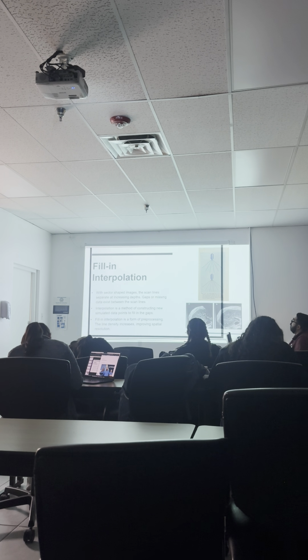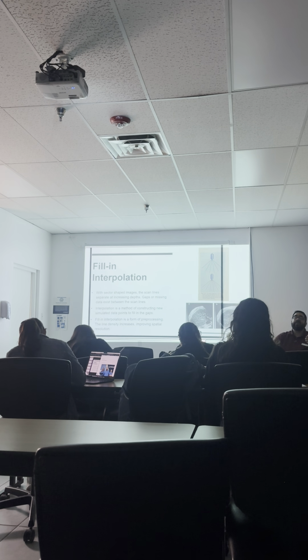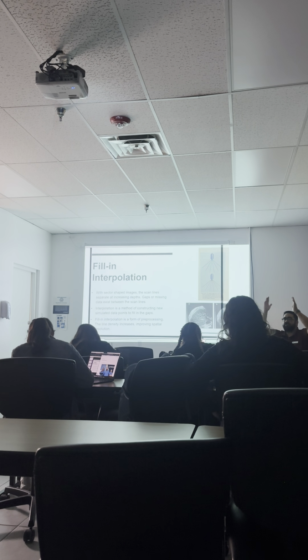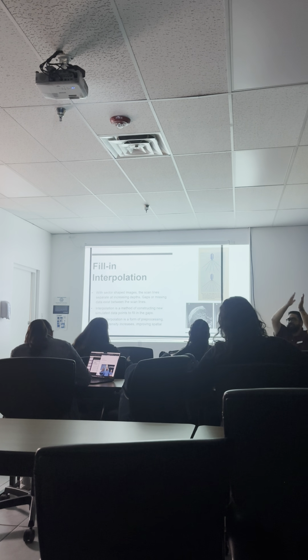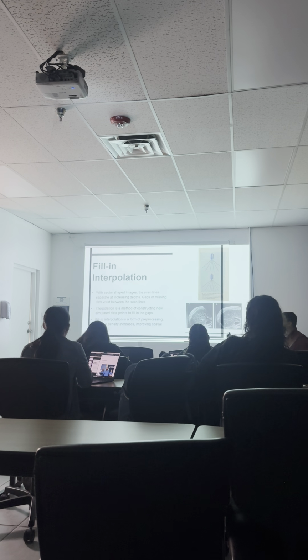Okay, so with sector-shaped images, the scan lines separate at increasing depths. On the curvilinear probe, it starts off, let's say, at 6 millimeters, but the more it travels, it deviates and deviates. Each crystal has that range of deviation, which creates a space once you get deeper into the patient. Is that good or bad? Bad, because the more space we have between lines, the more choppy our image is going to look.